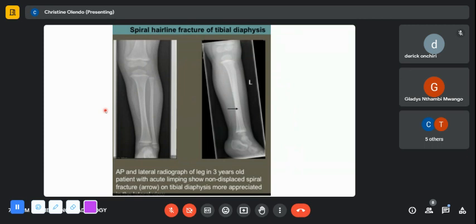Well, maybe if you follow the continuity of the bone, you might actually pick them up. There's been one or two studies whereby they have shown that you can pick up fractures, especially rib fractures, if you just go to where the patient is feeling the pain.